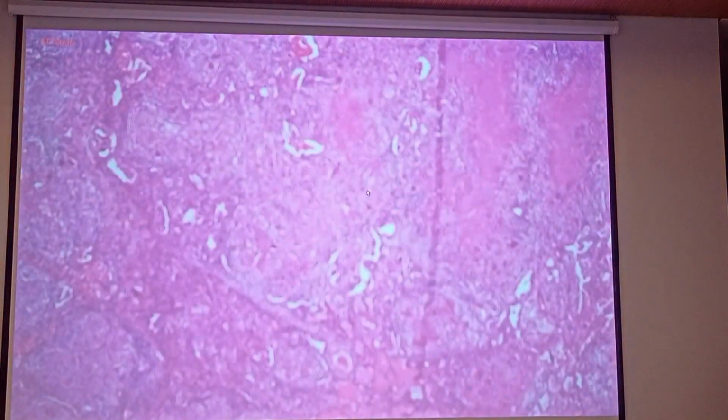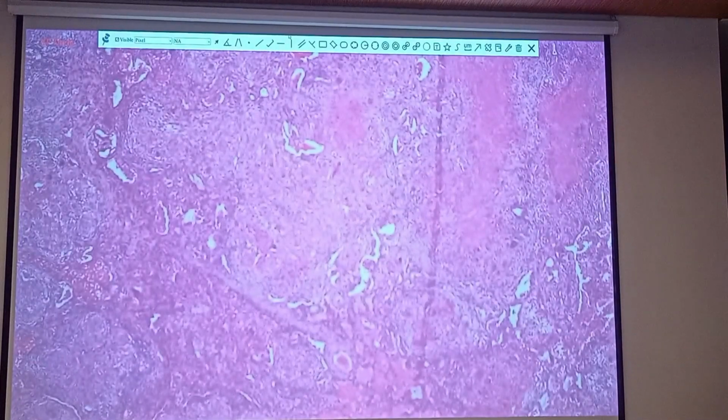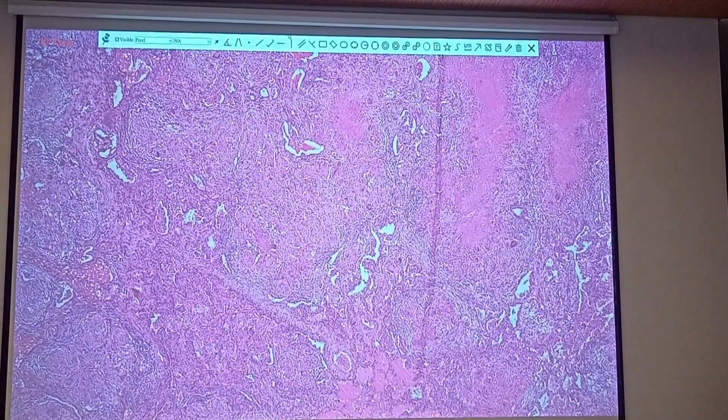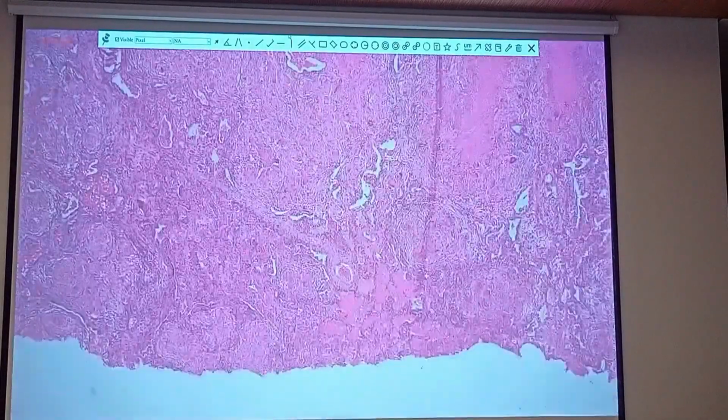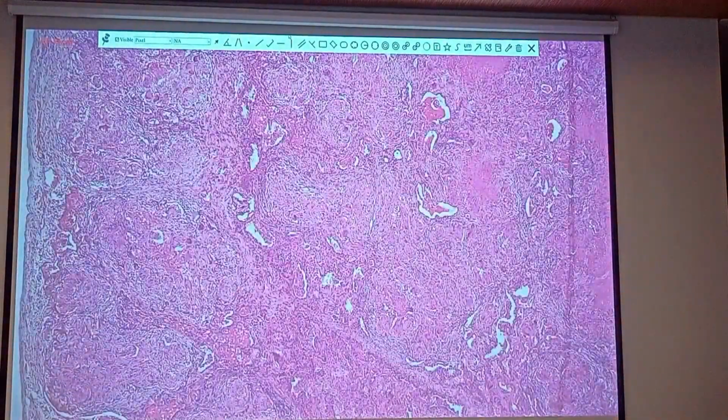So, ganito lang siya. The other one, which is also known as a granuloma, has caseous necrosis within it. This is it. Very classical, no? Yan. Numerous. And medyo extensive siya, no?